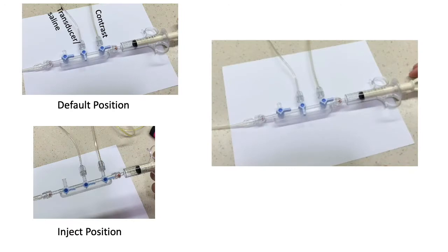So let's get started and look at a manifold as we have in the top left. The right port is for contrast. The other communicates with the transducer or the saline tubing.